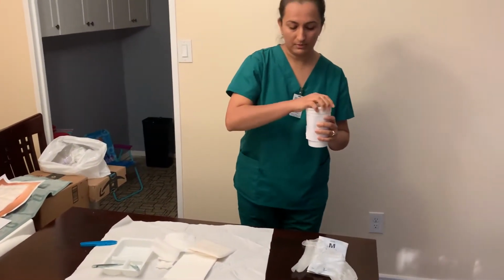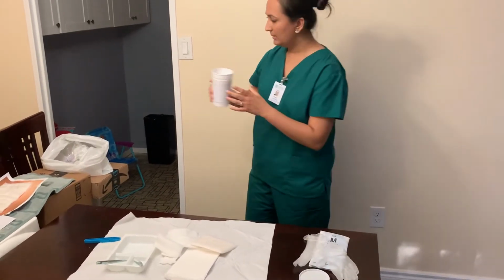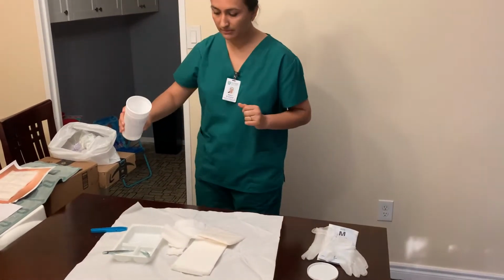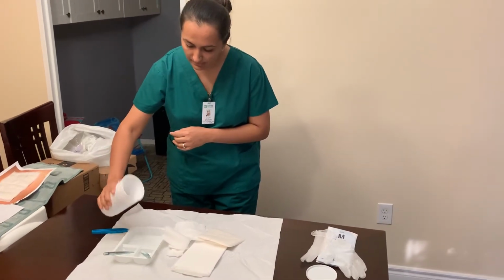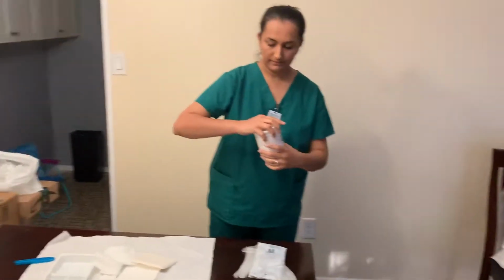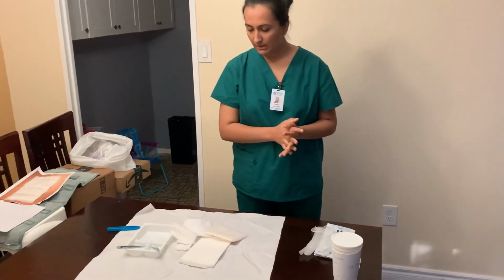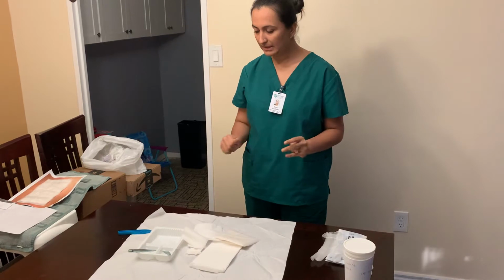The lid is going to be upside down. I'm going to lift the solution a little bit, and then we're just going to pour into our tray. That's it. And I'll just close it. Okay, so it's all good, you can see. Now we have the sterile field ready.